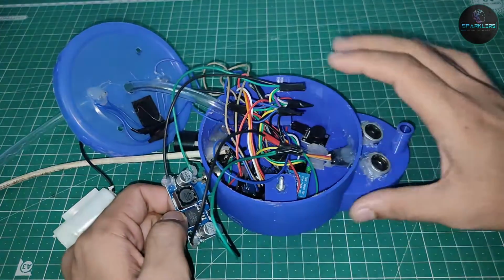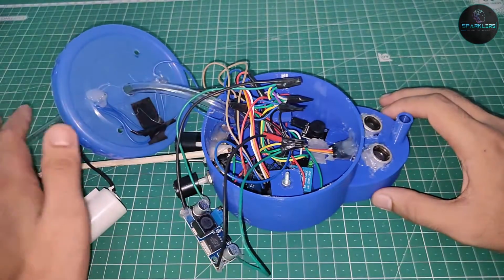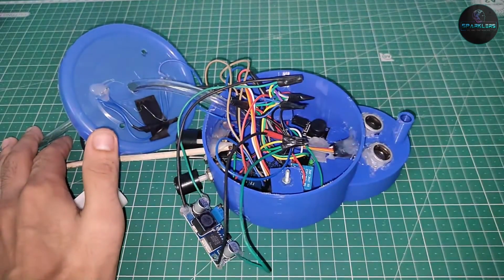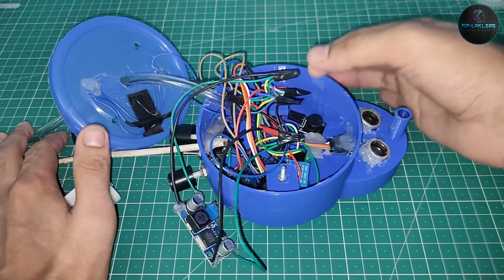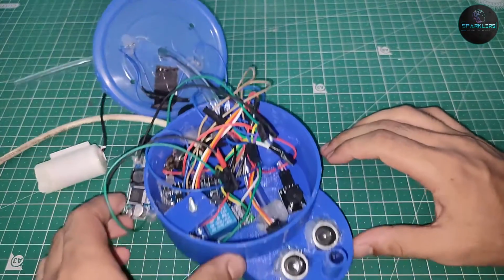It's a very simple module. You can search online and you will get it. But again, you can use 12 volts also, in which case it will be much easier. Okay, this is all about the power supply. So now we have a 5-volt positive pin and a ground pin. Now let's see how everything is connected.